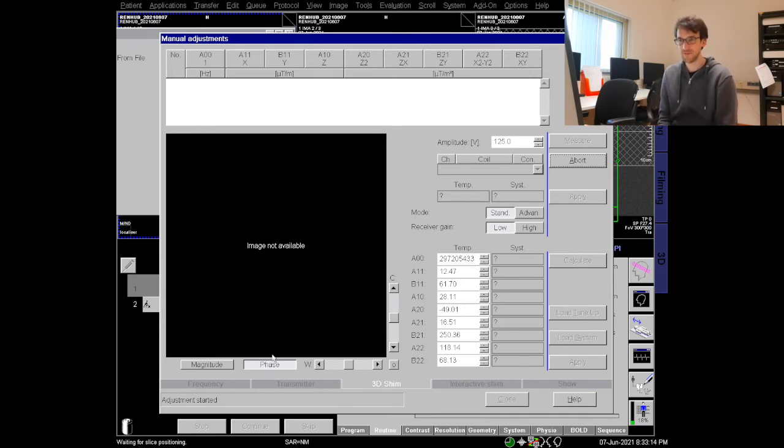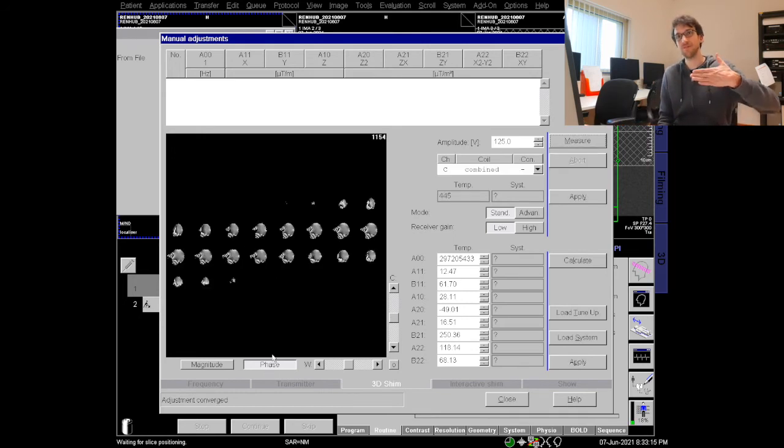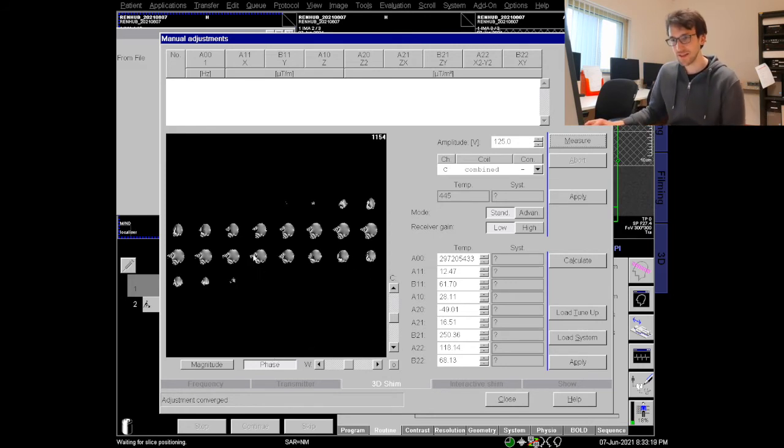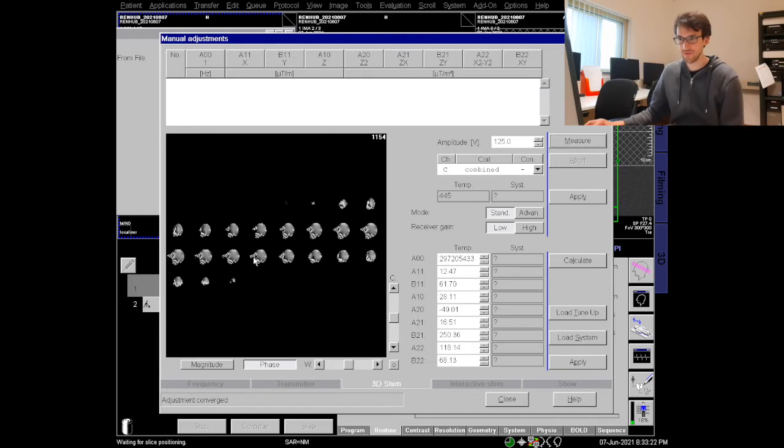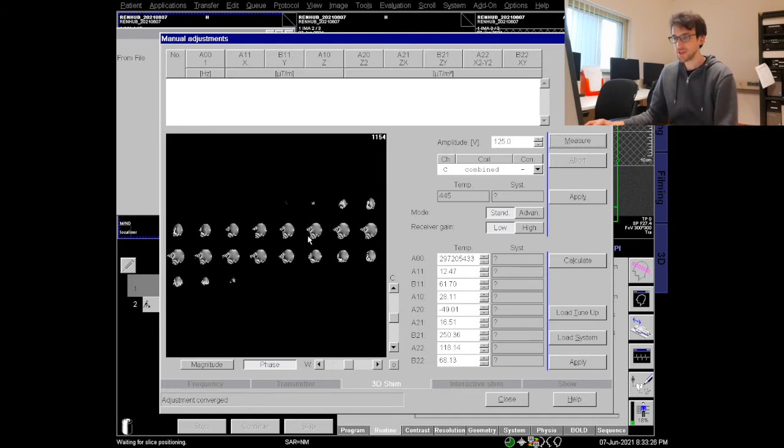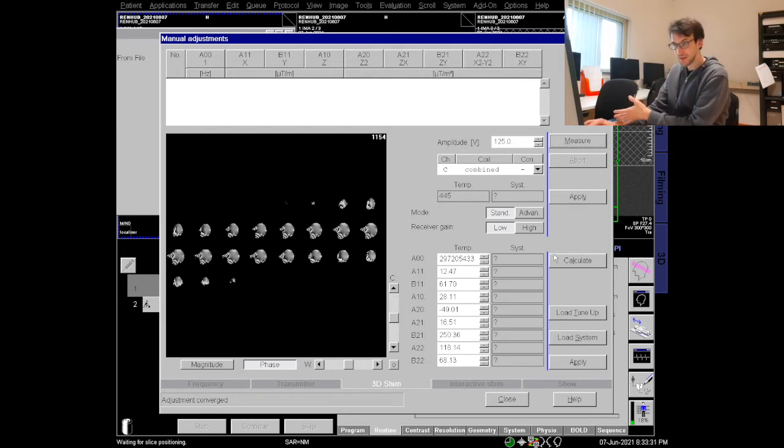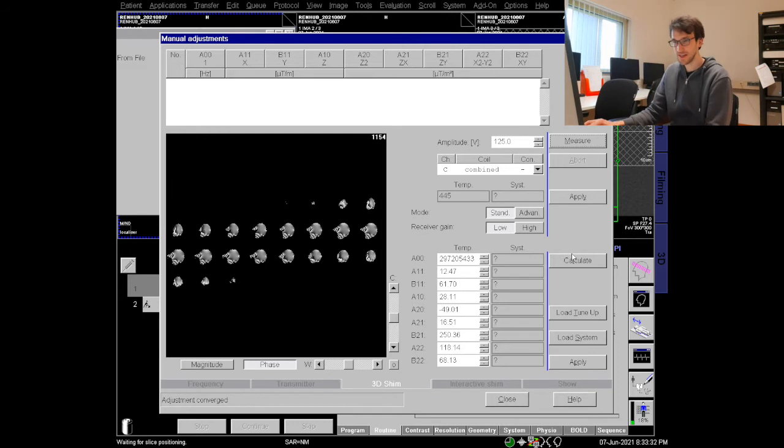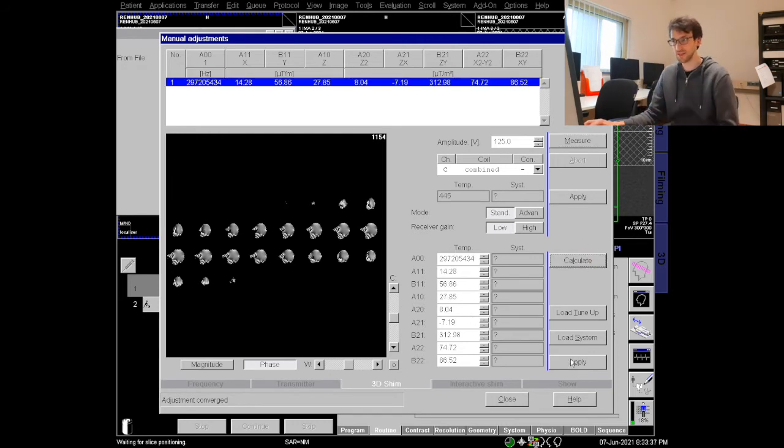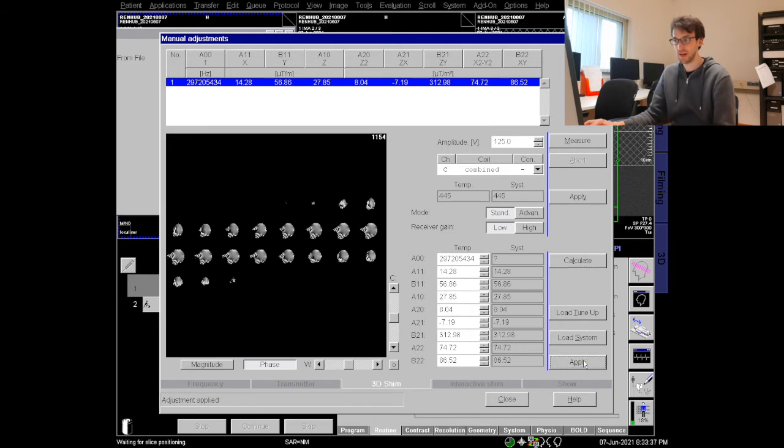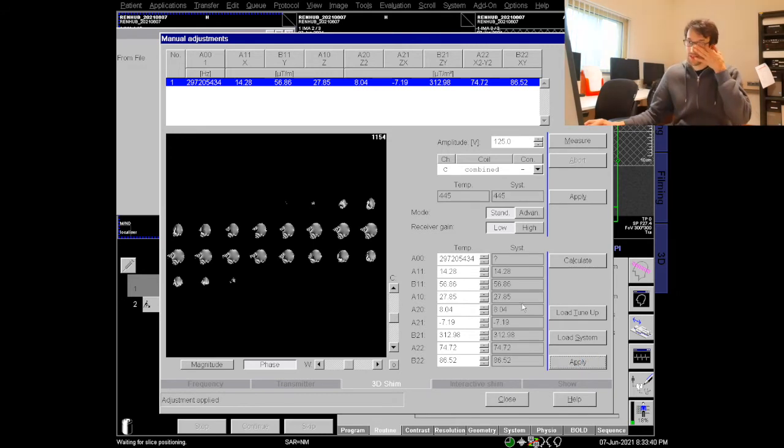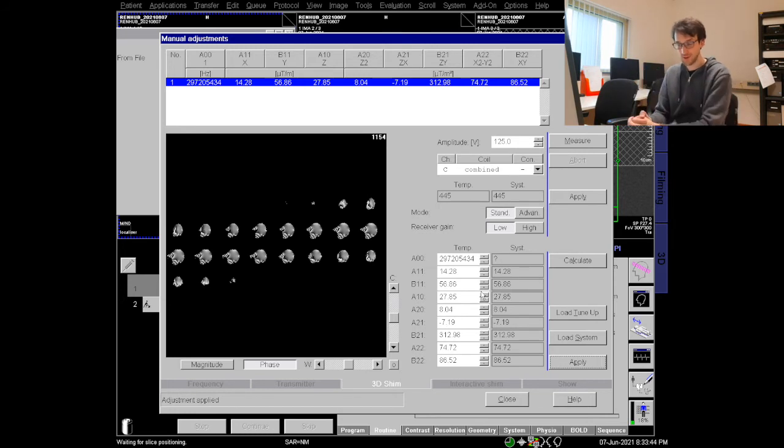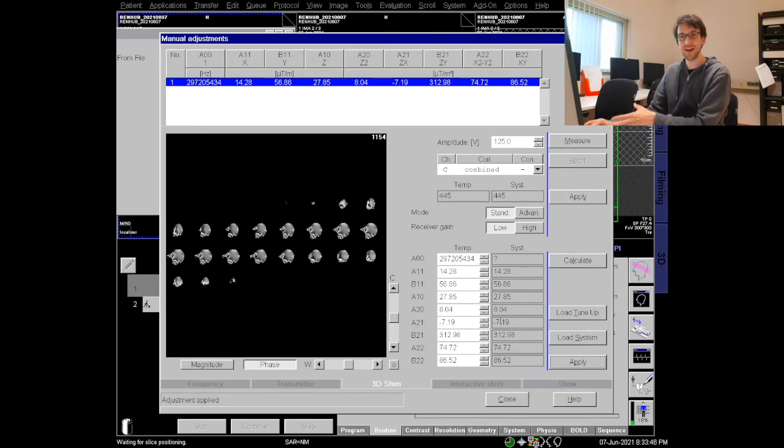The phases are selected by default in a kind of sagittal view. So here you see that down to the neck we have a lot of inhomogeneities, a lot of phase wraps. In our area of interest it actually doesn't look so bad already. So we can now calculate the necessary currents by clicking this button. So now they're in our temp and in order to load them into the system we click apply. Now it only applied the currents for the spherical harmonics up to second order. You also want to apply it now for the third order and this is where this little window comes in again. Now we click set third order shim and now these little zero values are getting finite values that makes sense.